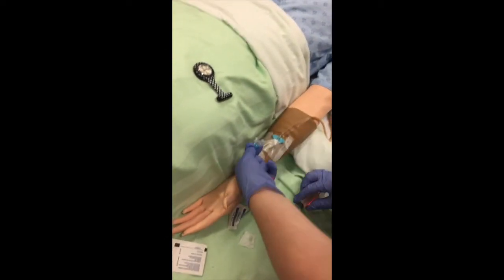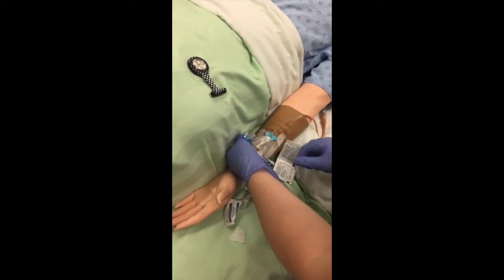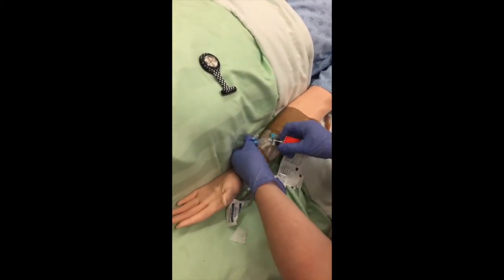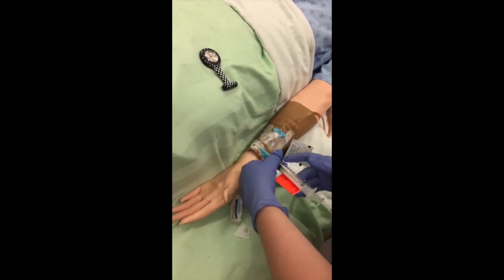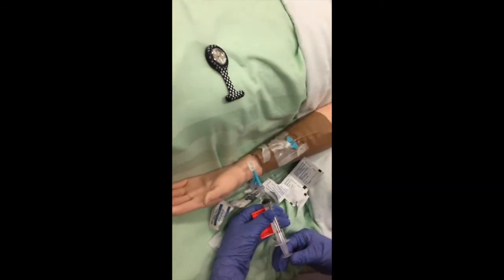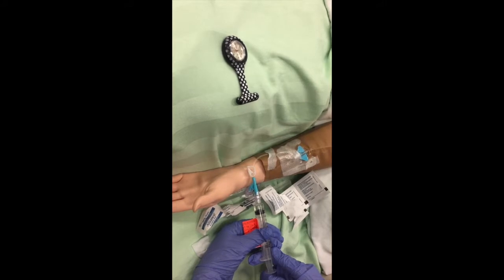So now I want to attach my morphine. First, actually, I want to re-swab the site, or this, the port. So again, for 30 seconds. So now I'm going to attach my morphine. So I know from my calculation in the monograph, I want to be giving this over 1 minute. So I'm just going to check that right now. All right, so starting now.